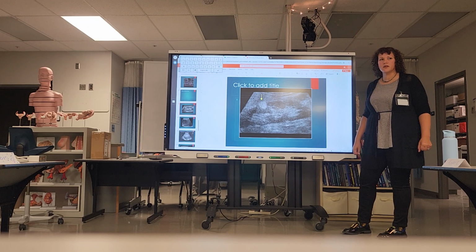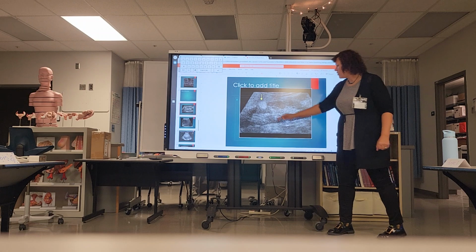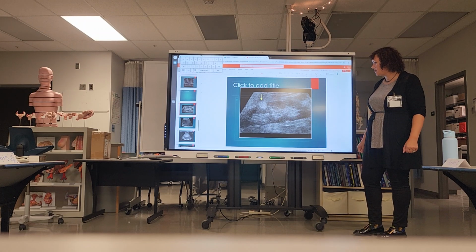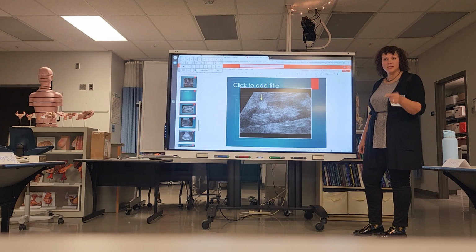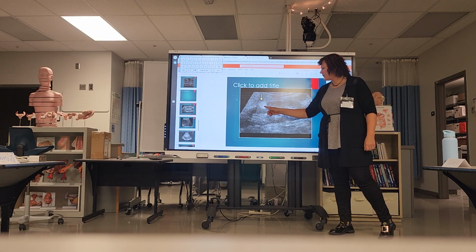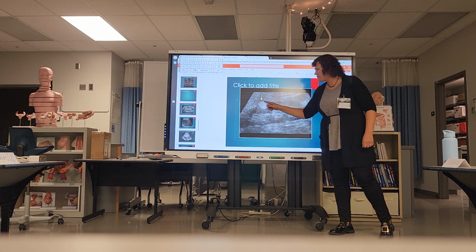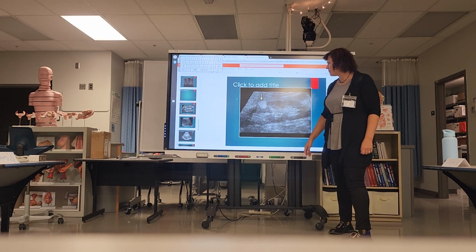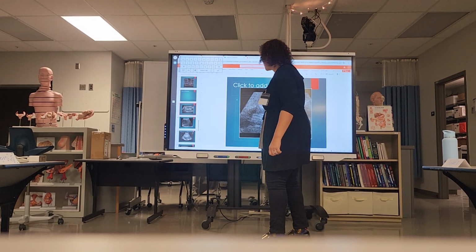How do we know that it's a solid? No enhancement. Is it calcified? It's echogenic. If it was calcified, it would have shadowing, correct? Yes. It's big enough that if it was calcified, this big old structure right here would give you shadow. So it's not calcified.